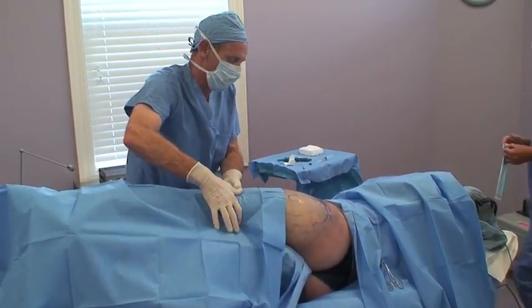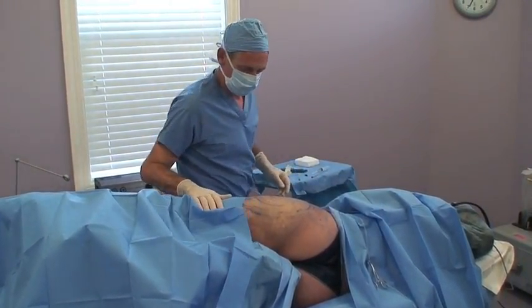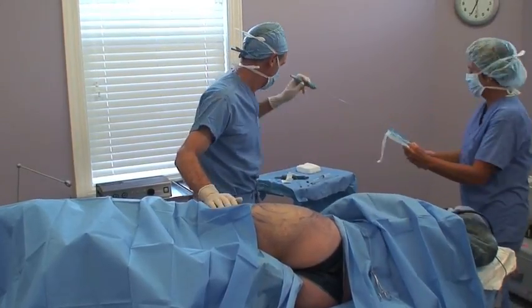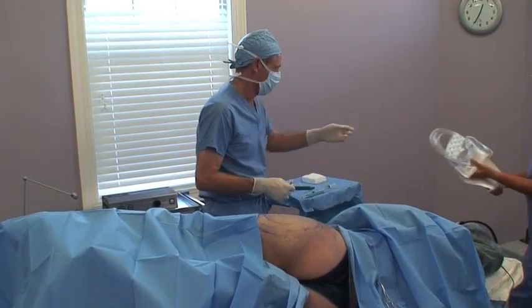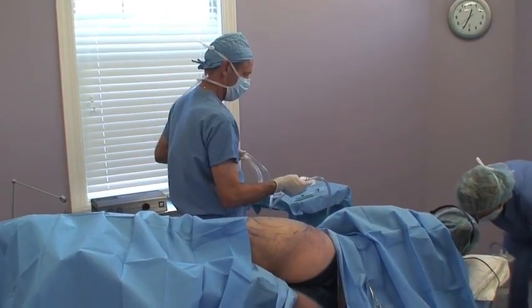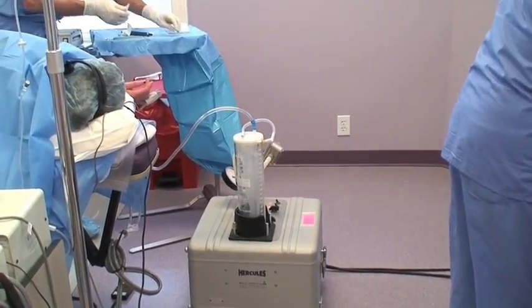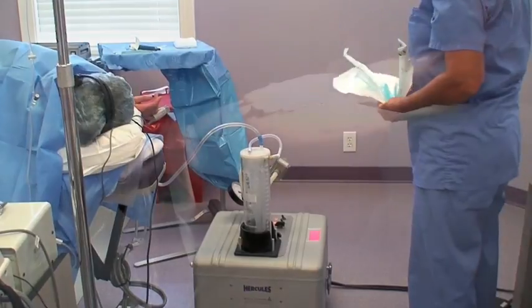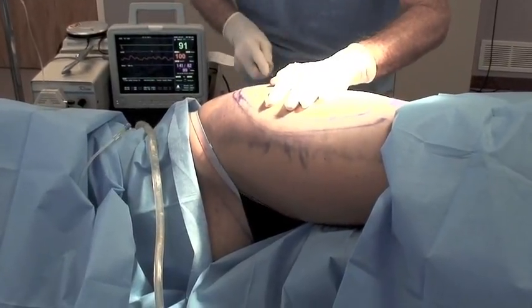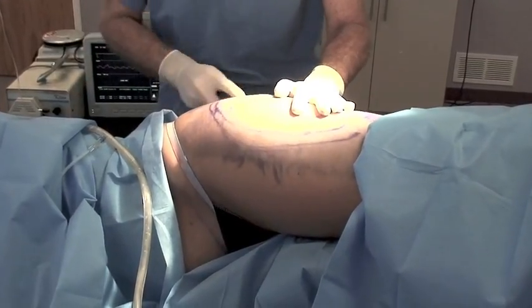The third and final step is the fat removal. This is where we take the fat out using very small cannulas. This is the suction machine — the canister where the fat will go. These instruments are very, very tiny, and that allows us to make extremely tiny incision sites that we don't even have to put any stitches in. There you can see the fat going out of the tube.